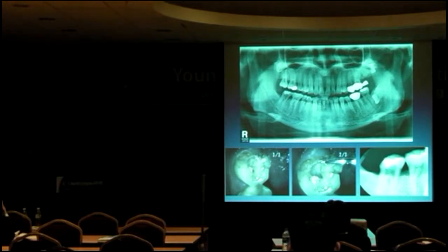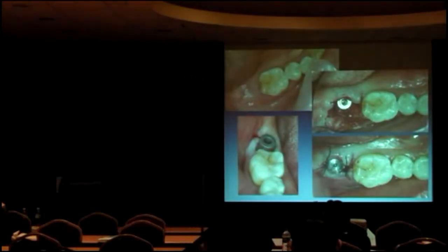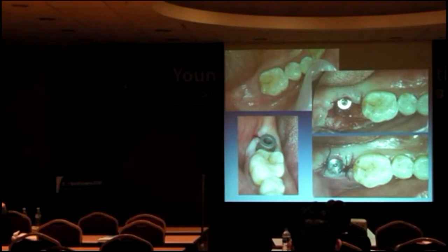So this is a single implant case. The patient came with a cracked tooth, number 47, and I was the surgeon, but I couldn't take it out right away. I spent a lot of time, and the tooth was squeezed out, and I spent more than an hour to take it out. Then I waited for two months, and I placed the implant.